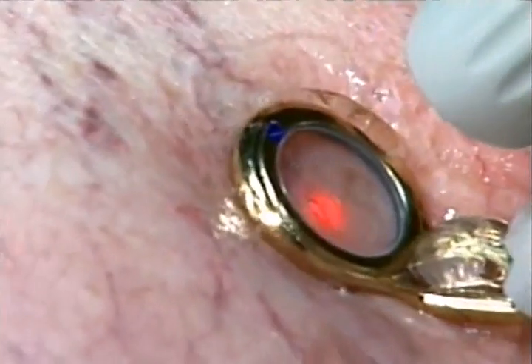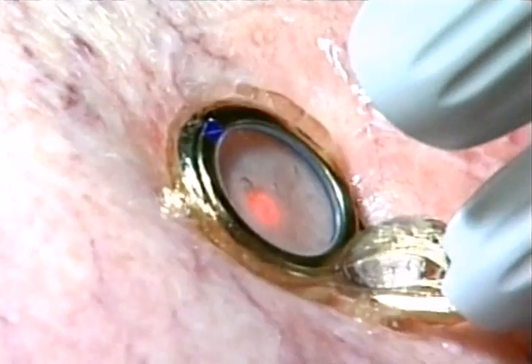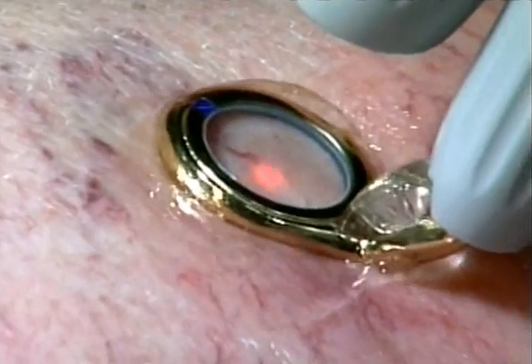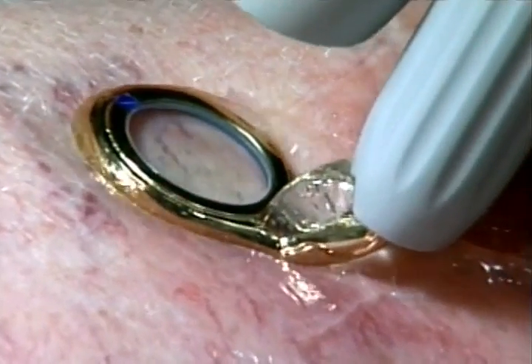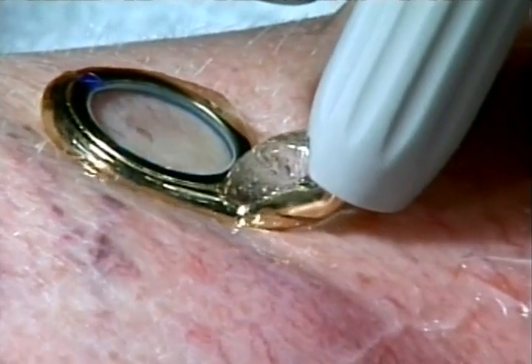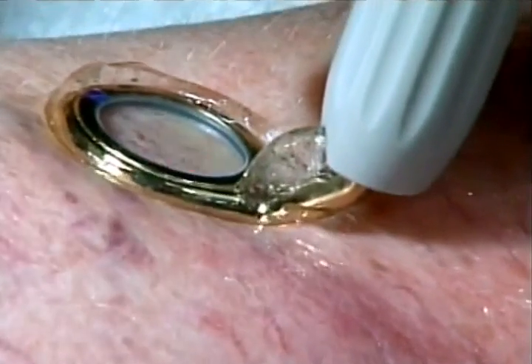Okay, now we got some bigger vessels. I'm going to want to use a larger spot. So I'm going to turn from 2 millimeters, I'm going to go up to 3 millimeters just by turning the dial. It takes just a couple of seconds, and it compensates with the pulse duration and the fluence for what I was using. So here we go with a little larger vessel and a spot size that is perfect for it. I get the exact same clinical endpoint that I was getting before, only treating much larger vessels.